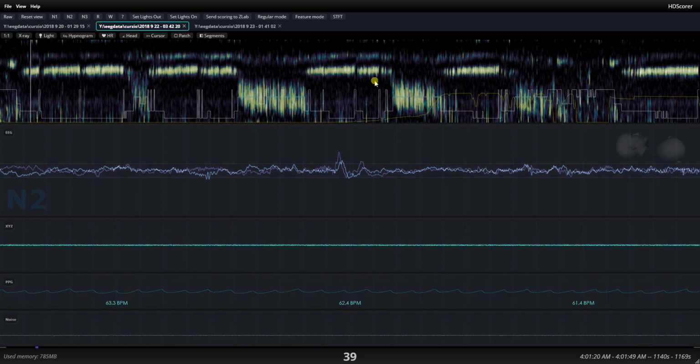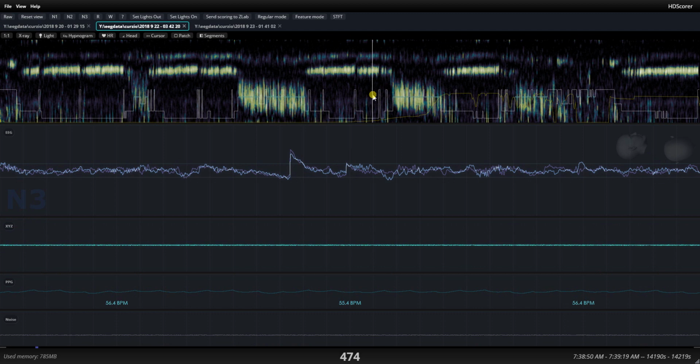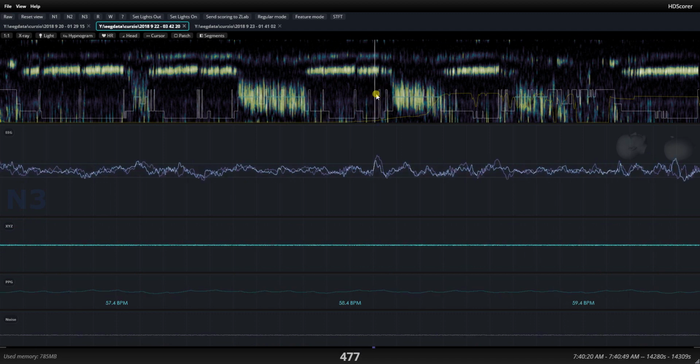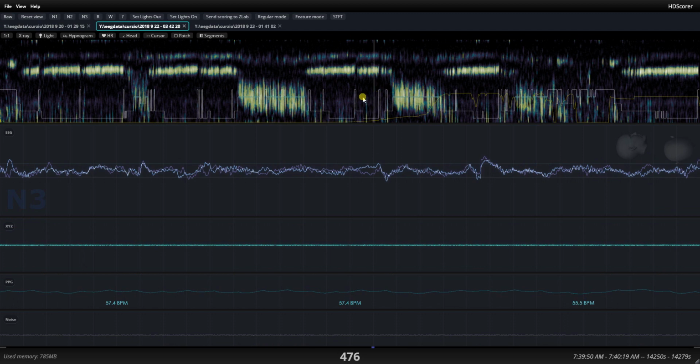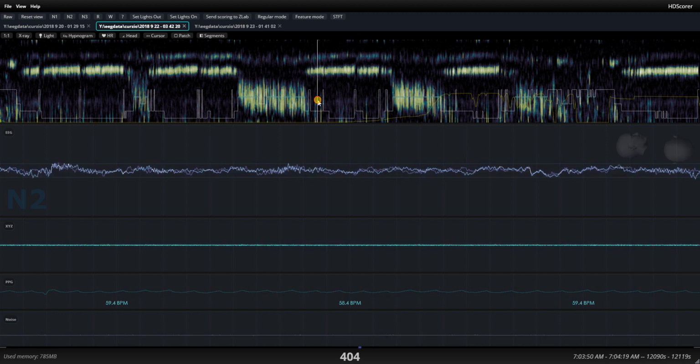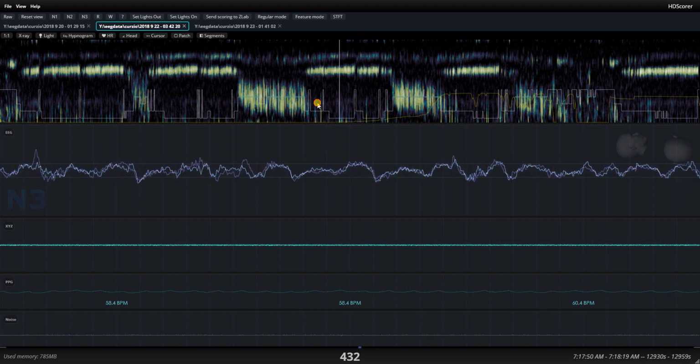Another couple of examples of what I was doing before, that is looking at N3, verifying that it's full of low frequency activity, and then going to an N2 phase and verifying that it's flatter. That works out. It works out here on this cycle as well.